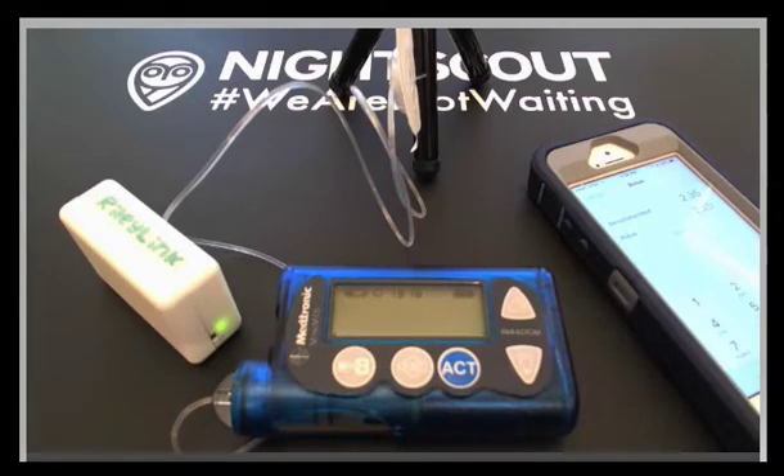This is our first remote bolus test. The Riley Link has a green light, which means it is communicating with the iPhone. It is paired, and in the loop software, we asked for the pump to tell us which model number it was, and it came back 722, so the pump is communicating with the Riley Link.